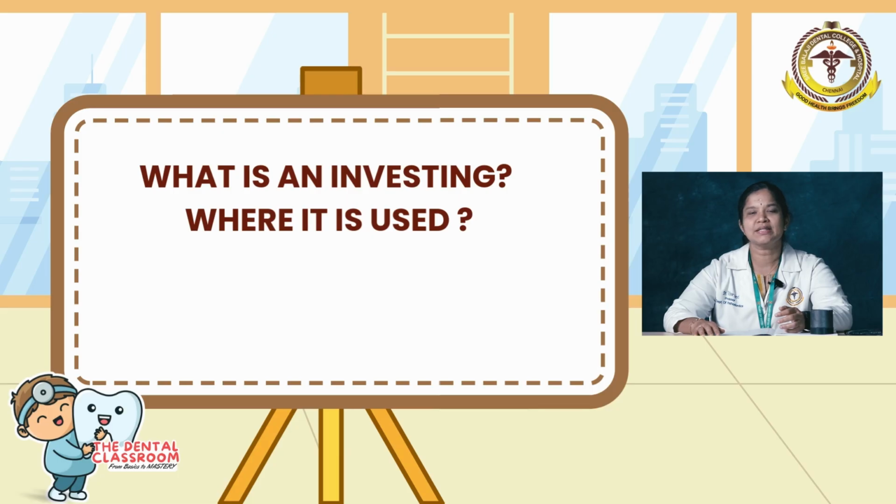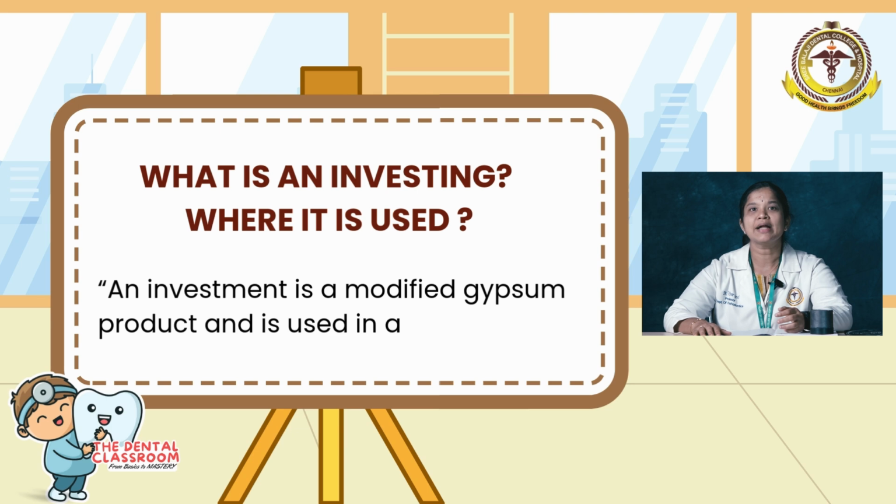and prosthodontists. Today's topic is investment material and casting procedure. What is an investment? Where is it used? An investment is a modified gypsum product and it is used in a procedure called casting.